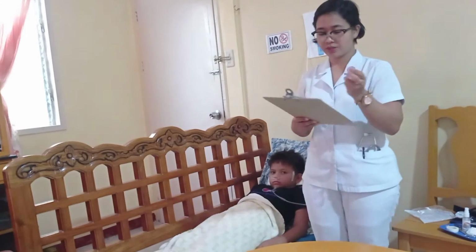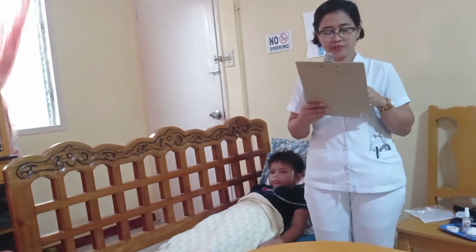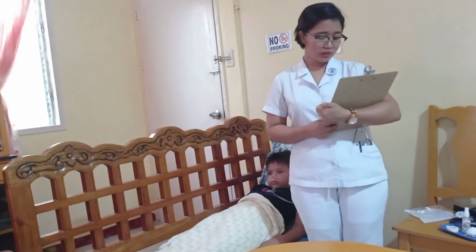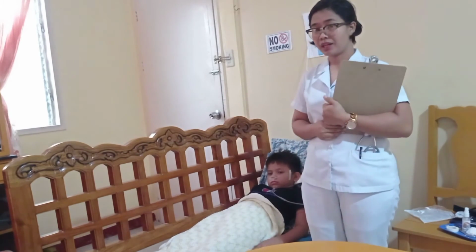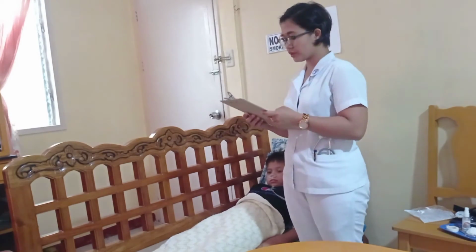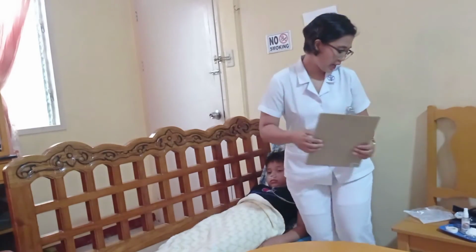So he had an oxygen saturation of 62 a while ago. Now I am going to check the oxygen saturation of our patient.